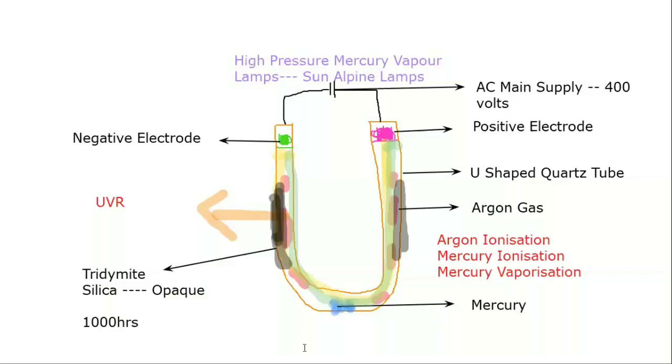of use. So इसके साथ हमको UVR तो मिलता ही है. Yes, we are getting UVR plus we are getting IRR because it is heating. We are also getting visible light. Clear? So high pressure mercury vapor lamps में हमको क्या क्या मिलता है? UVR, IRR plus visible light. So this is what we are getting. Now we would go to our PPT to understand the UVR.